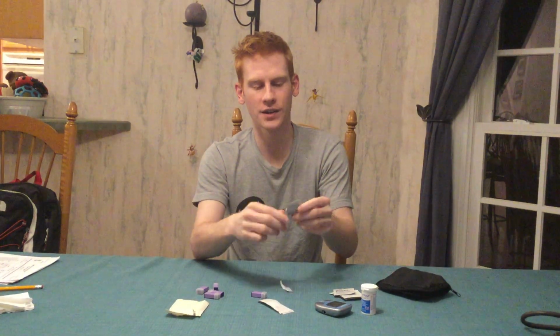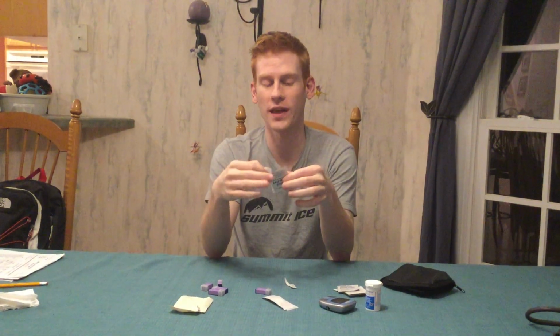So first thing we're gonna do is we're gonna wear gloves, or PPE. So I'm gonna check my own blood sugar, so I'm not gonna wear PPE, but if I were in a testing situation, hint, hint, I would verbalize I'm gonna wear PPE, or you would wear it if you're actually demonstrating it. You're going to first wipe off the area. So I like to do the lateral fingers. It hurts less. I find the way that makes patients hurt the most is when you amp it up so much. Like, oh, I'm going to stick you. It might hurt. We're going to count down very slowly, and that just gets them anxious. So do it quick on the side of the finger.